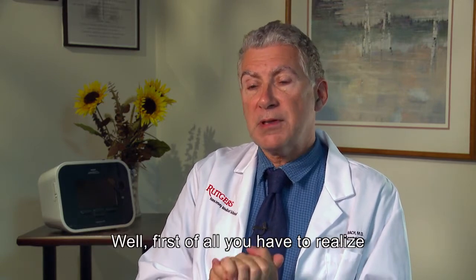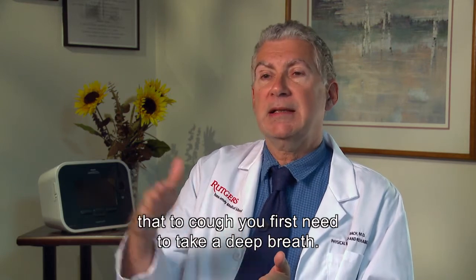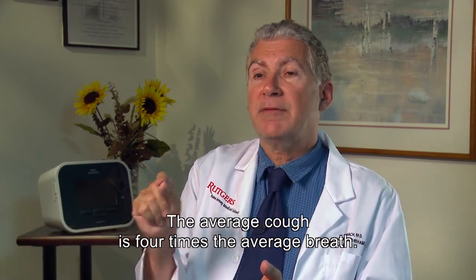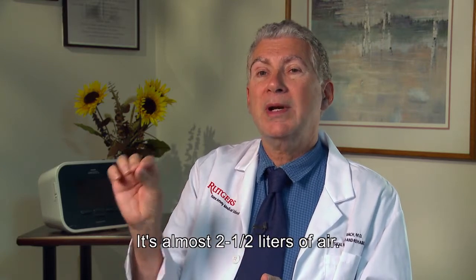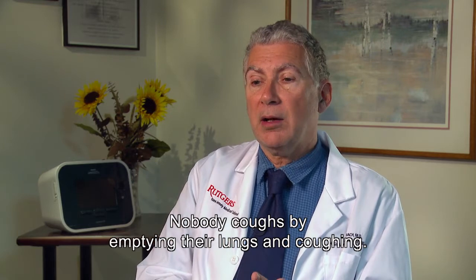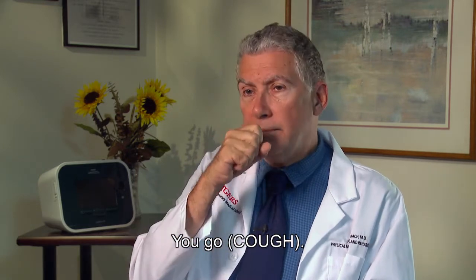Well, first of all, you have to realize that to cough, you first need to take a deep breath. The average cough is 4 times the average breath. It's almost 2.5 liters of air. Nobody coughs by emptying their lungs and coughing. You don't go, you go, okay.